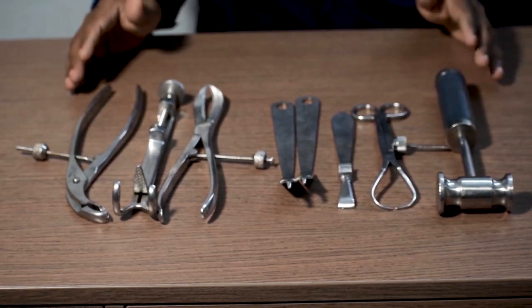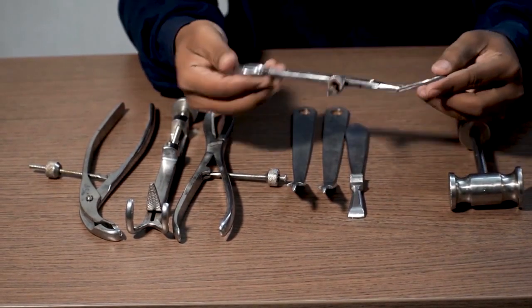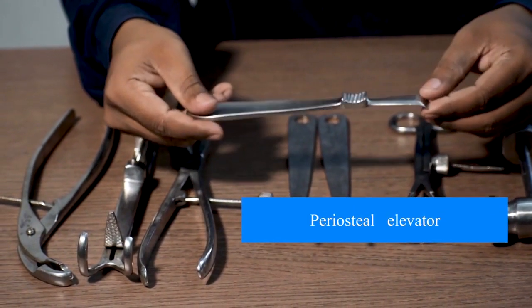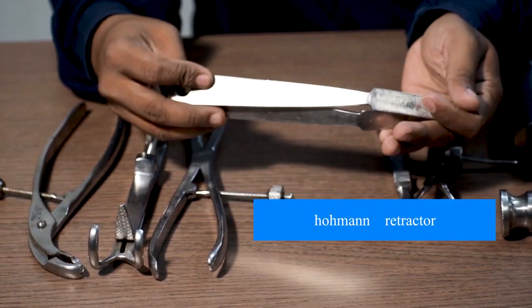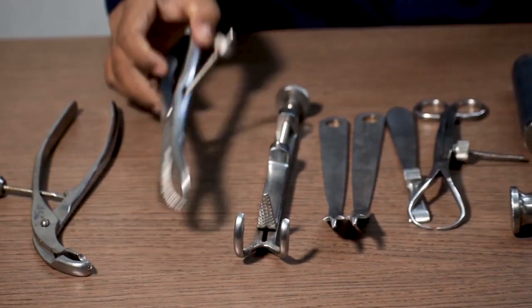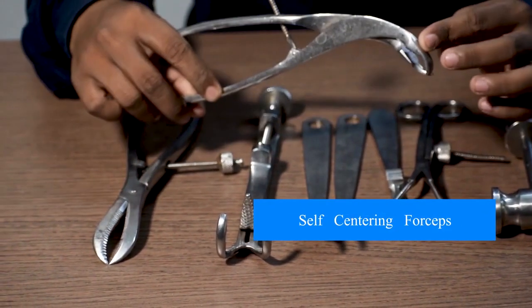Coming down to the general instruments: this is a hammer, this is pointed forceps or a pointed clamp, this is a periosteal elevator, this is called a Hohmann retractor, and this is called a Lowman's bone clamp. This is reduction forceps. This is self-centering forceps.